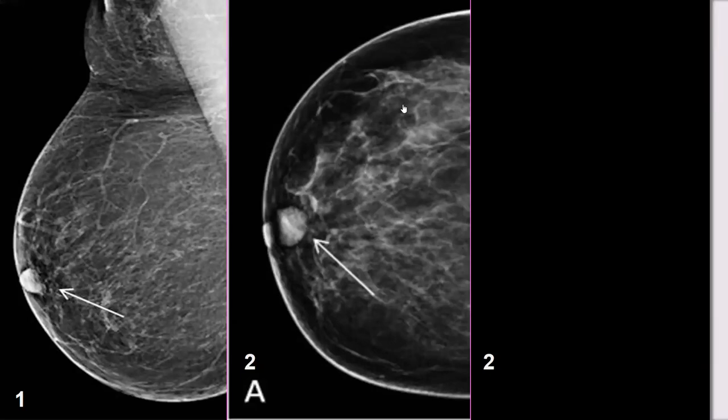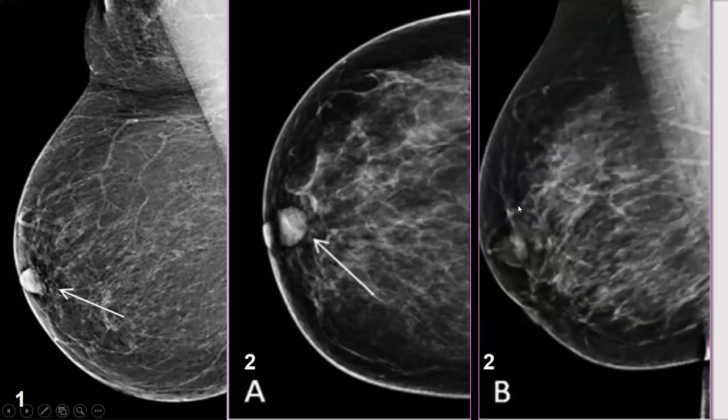If the nipple is inverted, the fat of the breast, anterior and posterior, we can see how it is projected. How can you analyze it, how will you be sure? I do another projection, a traction on the nipple out. Another projection, you are right. You have to see the other projection, the other view. It's important to see the other view. That is the other view.